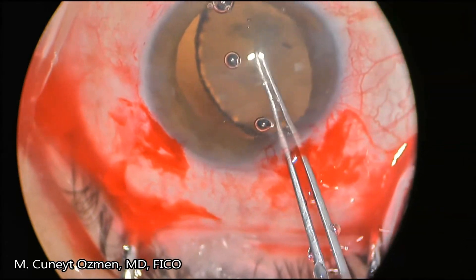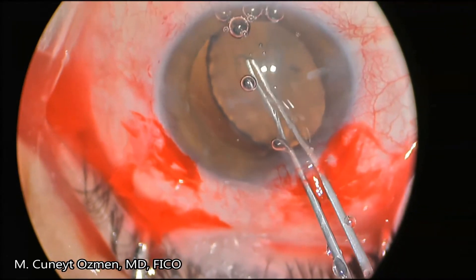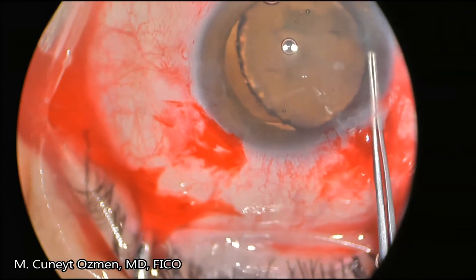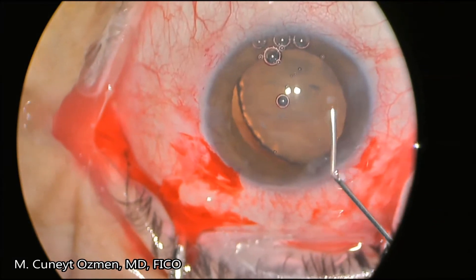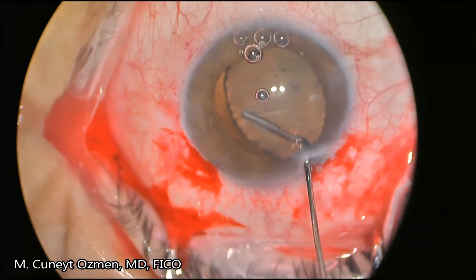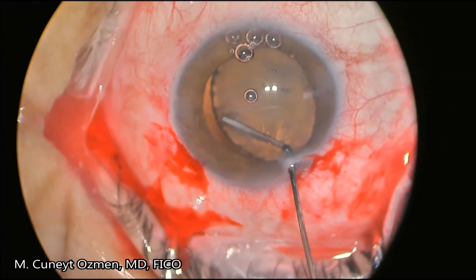In this case, we were able to finish the capsulorrhexis without any additional maneuvers. Usually we don't see the equatorial region of the lens, but in this case we can see it, and I'm going to show you in slow motion how the hydrodissection works.